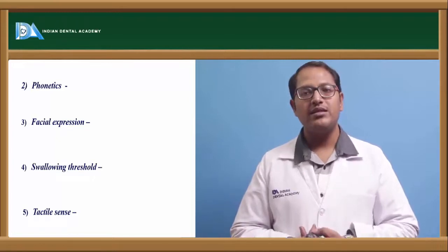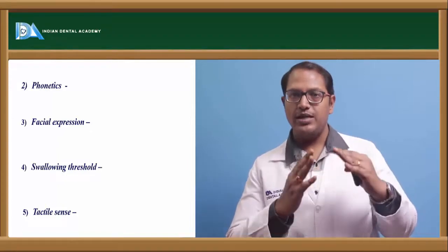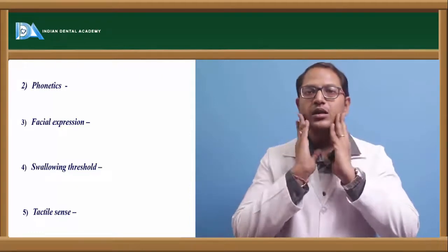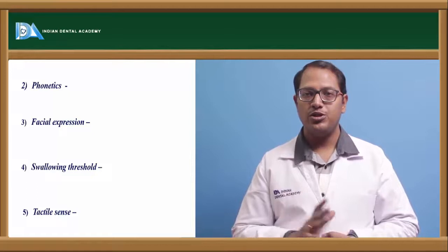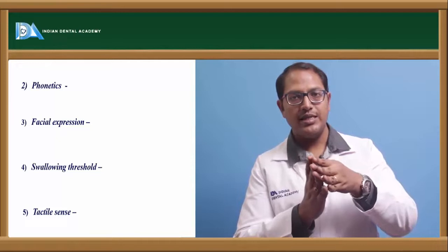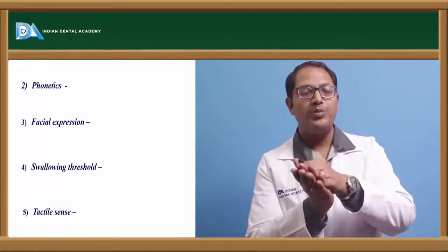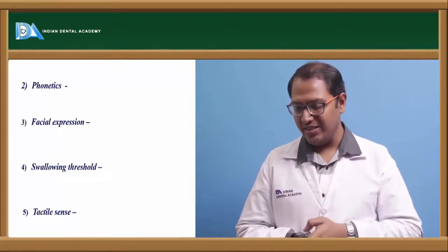Tactile sense. This measurement method is another beautiful method. After putting your maxillary rim and your mandibular rim, which you have put in hot water before and then placed intraorally, you ask the patient to close. Close till the patient feels all the musculature is in a tonic relaxed position, as in the physiologic rest position. When the patient feels it is in the proper position, the wax rims first get decreased, and at the position where the patient feels it is comfortable, the wax rim is stopped. That position will be our proper vertical dimension. That height will be maintained by the patient using his tactile senses.